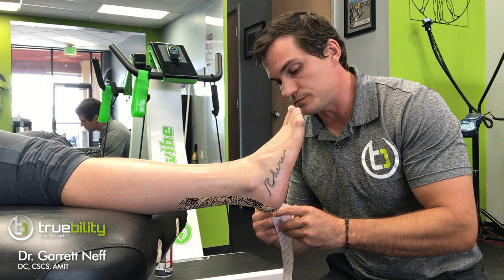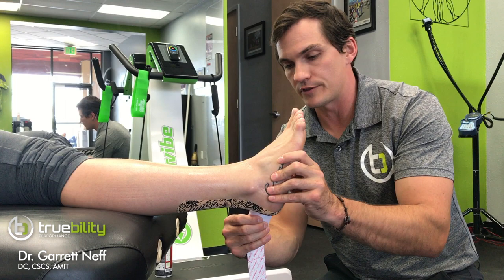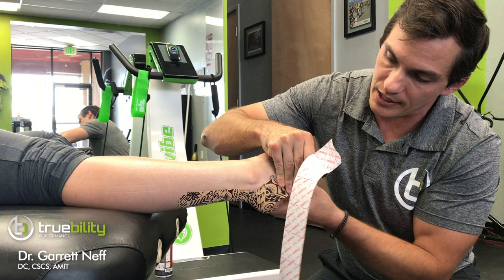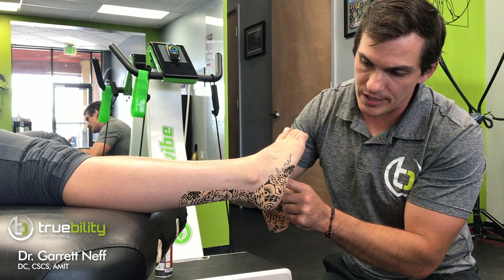In this case, I'm going to start right in the mid arch of the foot and run right along the line of the arch — not on the bottom of the foot, but right in the middle. I'm going to come back through the heel, and this is where it gets important: I'm going to create what's almost like a heel lock where I invert the heel a little, swoop around the heel, and come underneath the arch of the foot. So I start with the arch, go straight back around the heel, come down underneath, and that creates that inversion moment.